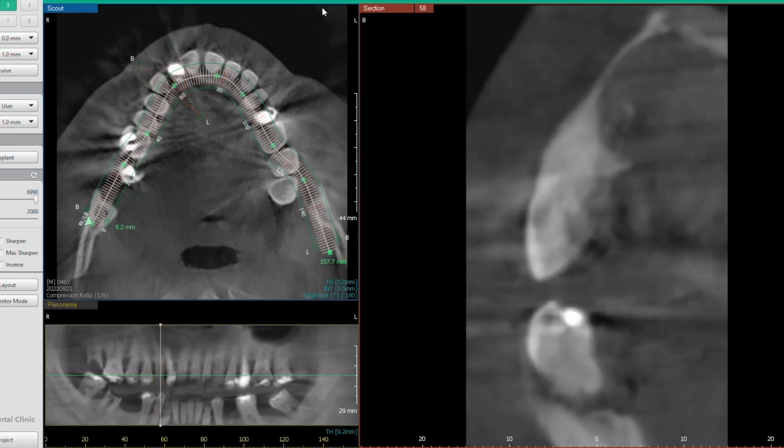Well, why is that an issue? Well, when we're placing all-on-4 dental implants, what we want to do is we want to place at least 4 implants. And what we want to do is we want to spread them equidistantly apart. So we want to get enough supports where we're going to be chewing, right? So we want supports up in the front, we want supports in the back.